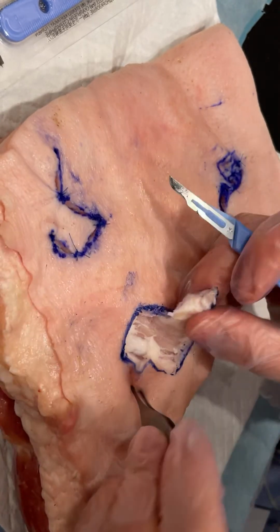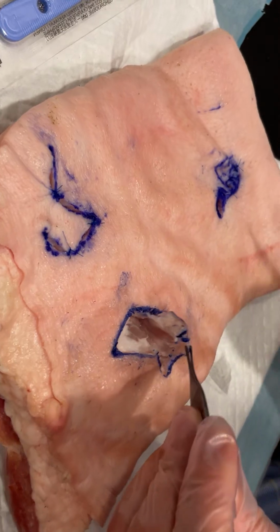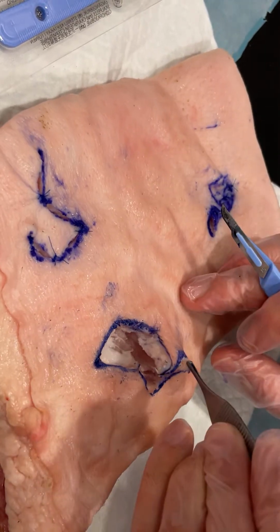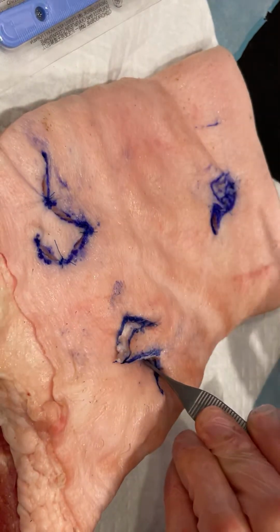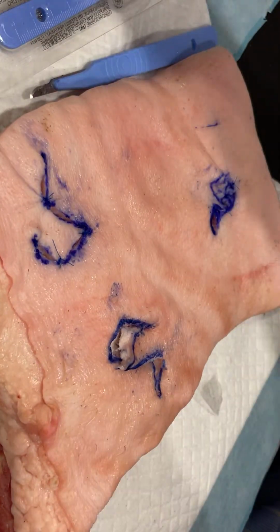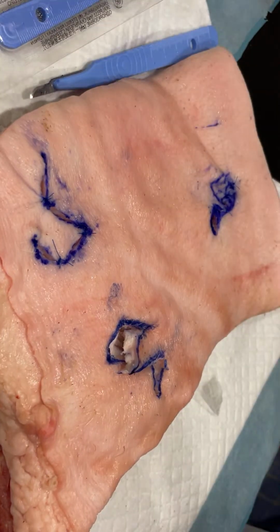Now the first step is to inset your donor site. So this is your donor site, so you want to close this. So you take a stitch from this corner to this corner here, and then your flap falls into place. So we'll just get the stitches. Can I borrow it over there?